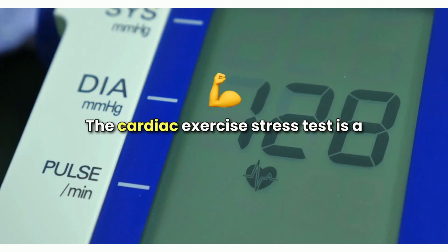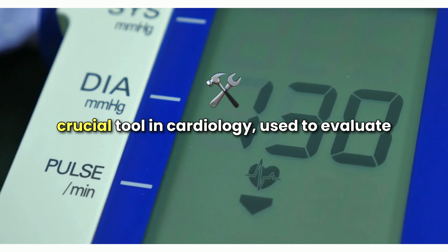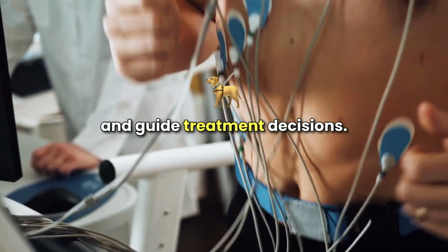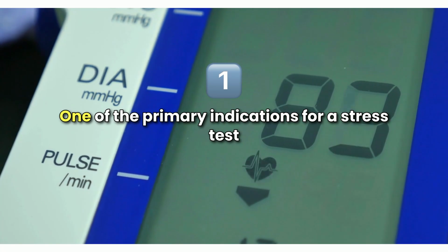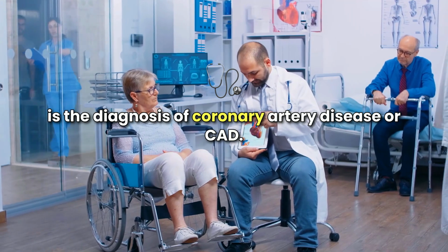The cardiac exercise stress test is a crucial tool in cardiology, used to evaluate heart function under stress, diagnose heart conditions, and guide treatment decisions. One of the primary indications for a stress test is the diagnosis of coronary artery disease, or CAD.